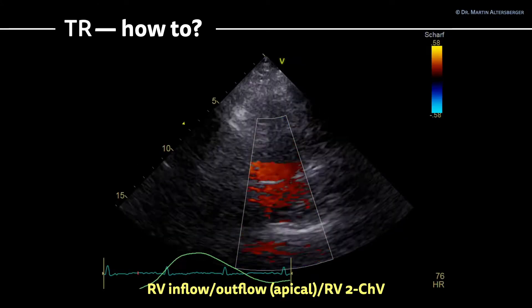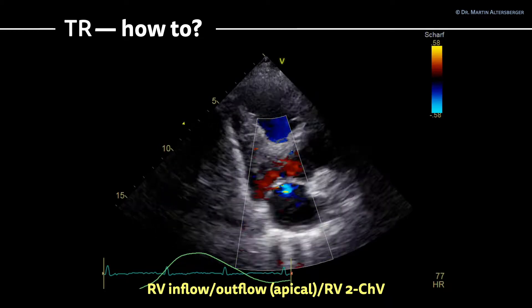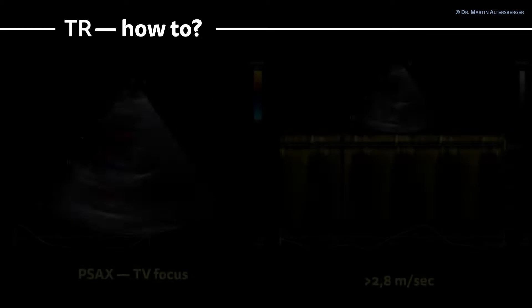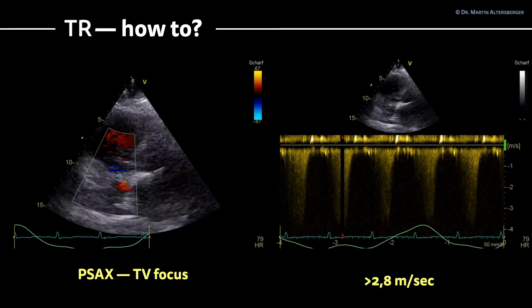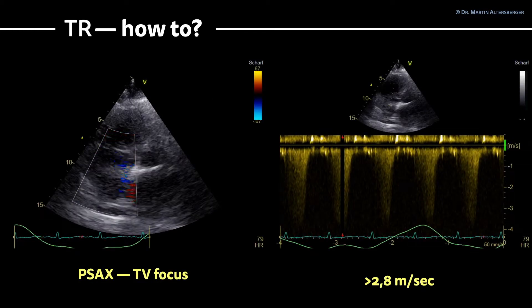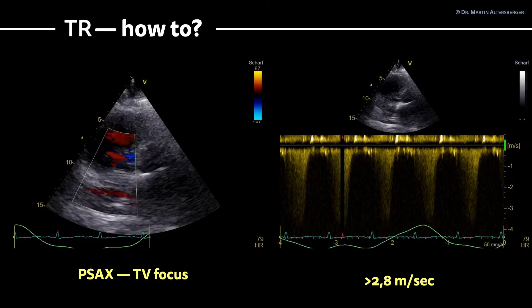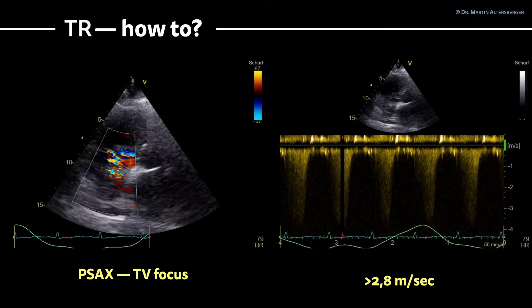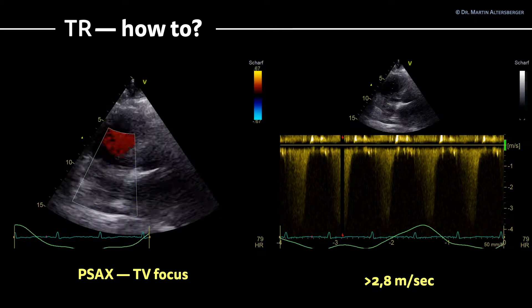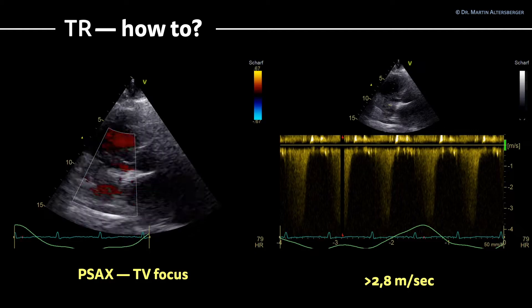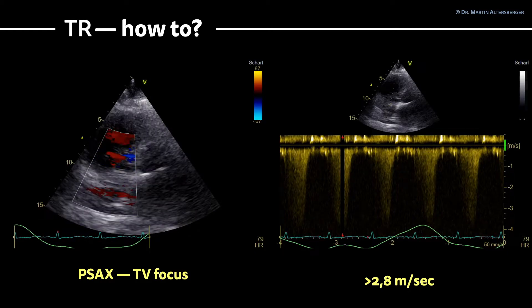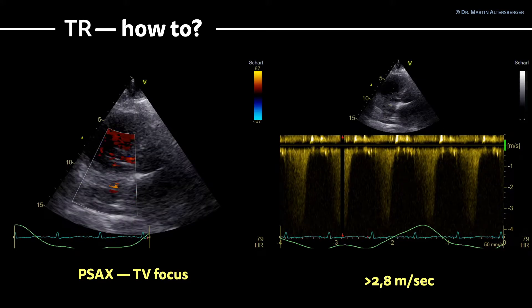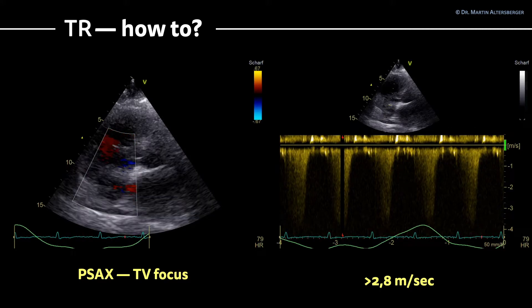Does it really work and can we measure the same velocity every time? The image quality has to be sufficient. Another possibility is the parasternal short axis view with a tricuspid valve focus. You go to the parasternal short axis view, focus on the tricuspid valve, and use continuous wave Doppler. The signal here is not optimal, but we can see it is far exceeding 2.8 m/s — it is in the range of 3.5 to 4 meters per second.